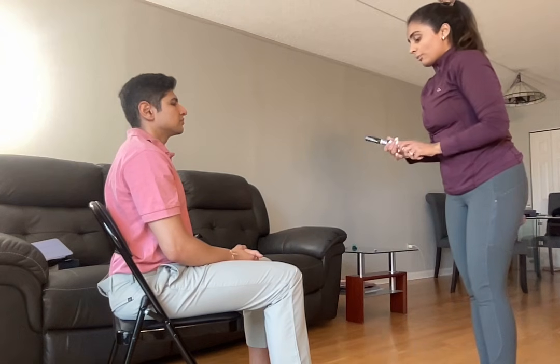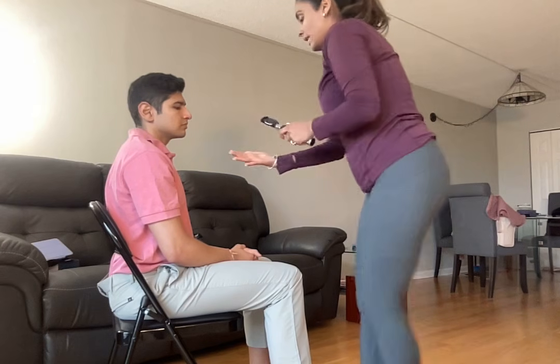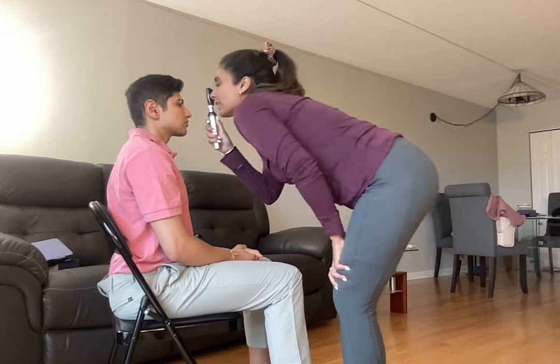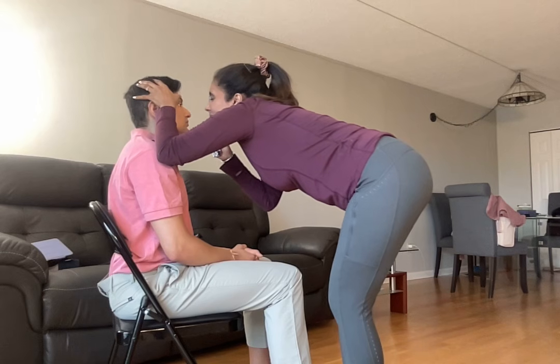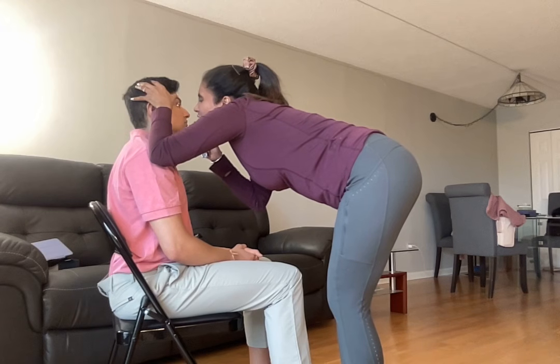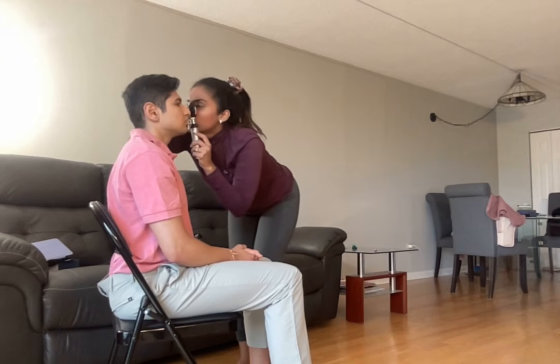Okay, and now I am going to use this ophthalmoscope. I'm going to stand at a 15-degree angle from my patient. My diopter is set at 0. I want you to keep looking straight and keep your eyes open. I'm just going to use my hand to steady, and I'm looking for the red reflex. Okay, and I can see it. I can see the optic disc. I can see the macula and fovea. No macular degeneration noted.